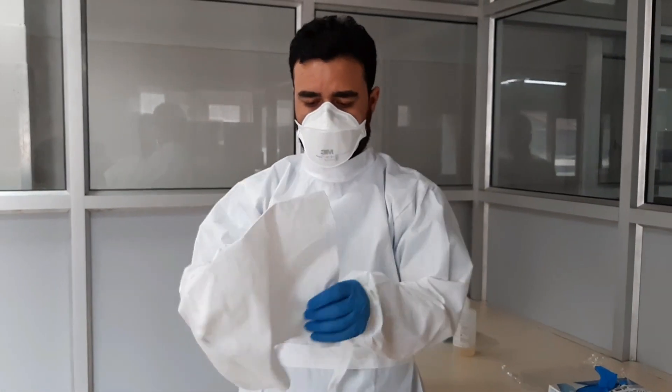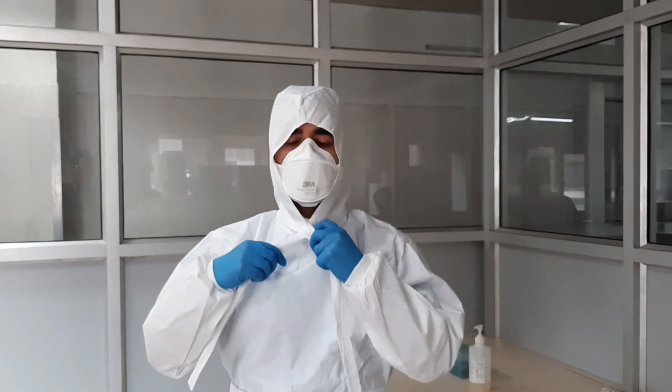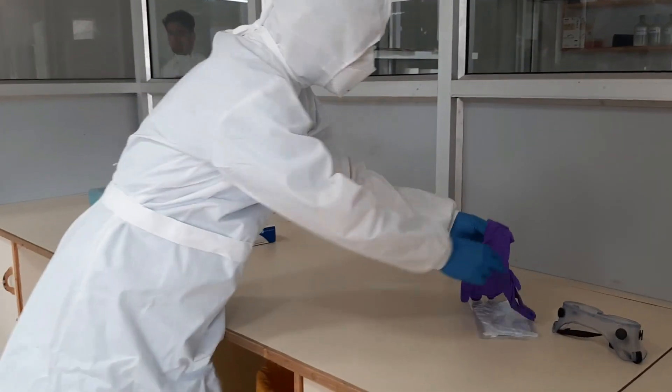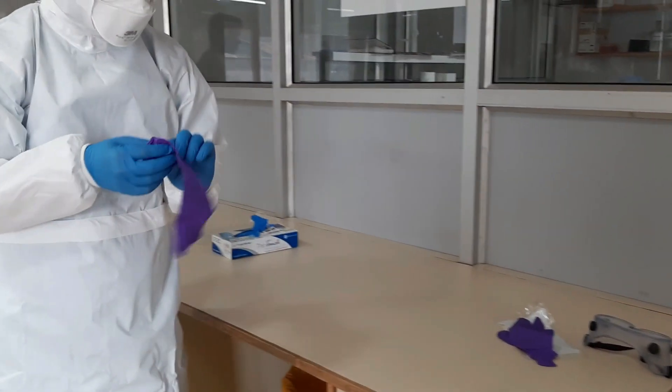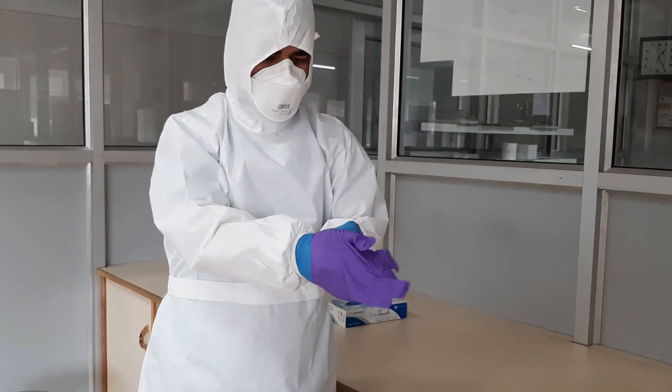Wear your skull cap or surgical hood. Ensure that your skull cap is adjusted well by observing the correct donning. Wear a pair of gloves to cover the cuffs of your PPE.